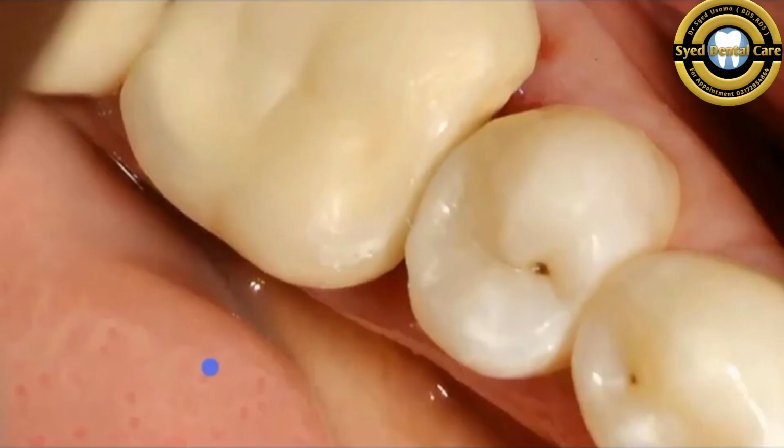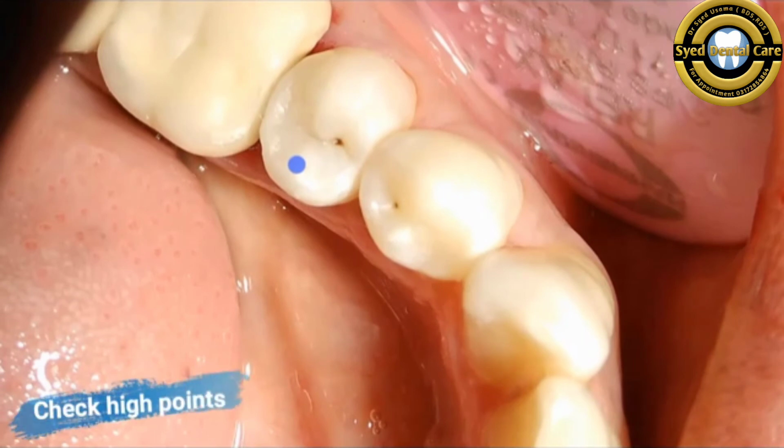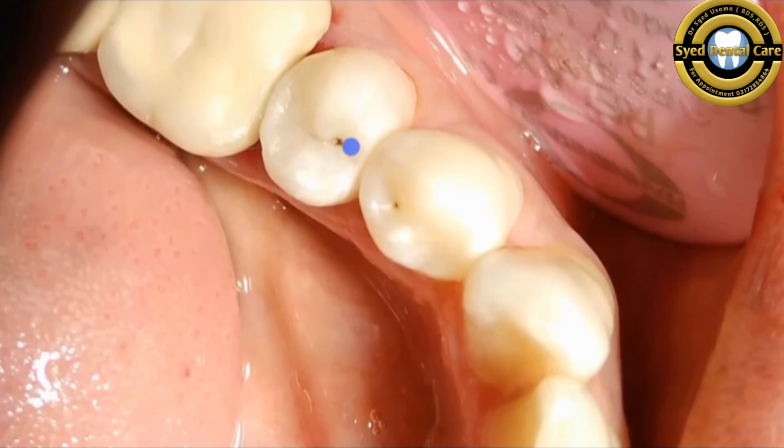Now let us see this clinically. This is the clinical picture after the restoration was done. This is one more. Now we have to check for any high points by asking the patient to bite, and the excess flash, that is the excess material, has to be cleaned using a yellow ring grit diamond point, which is basically a tapered shaped bullet, or a Soflex disc can also be used.